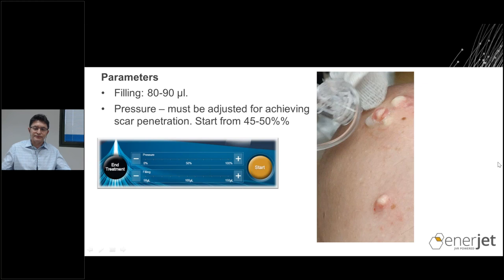Okay, longevity with cross-linked HA and non-cross-linked HA, and what is the treatment protocol for both HA, total sessions required? It depends on what you are treating. If we're talking about atrophic scars, acne scars, we usually recommend three treatment sessions, 1 month in between.